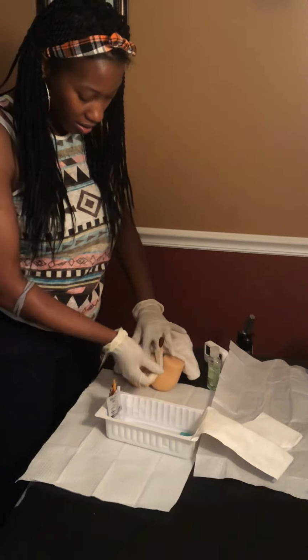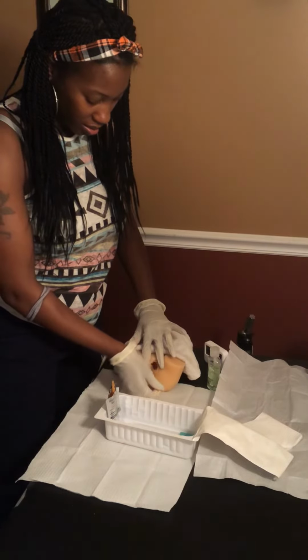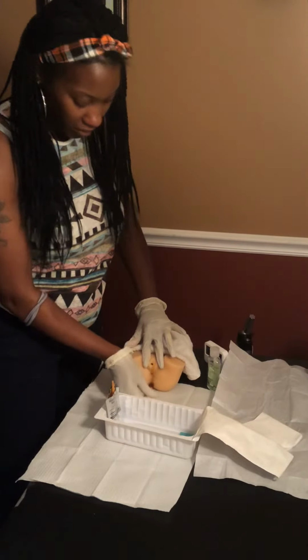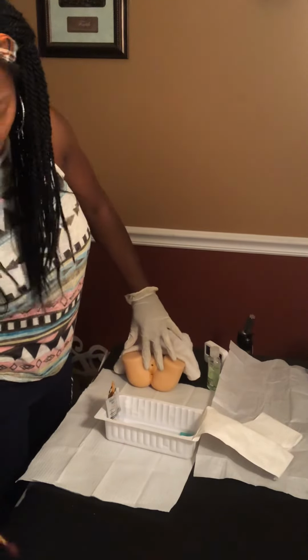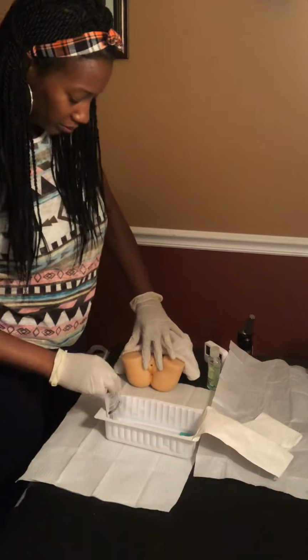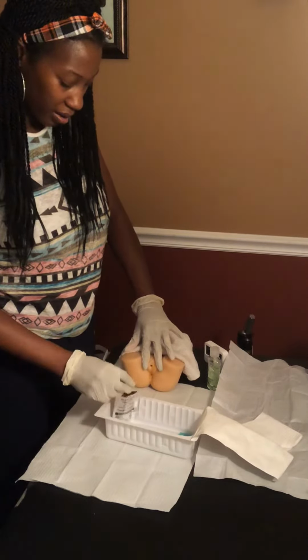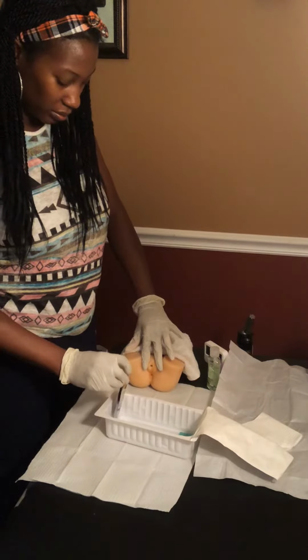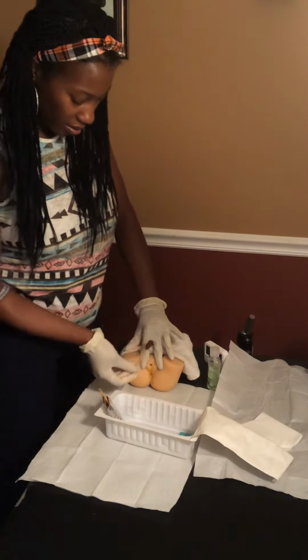Far labia. One swipe down. That in the trash. Front to back. Near labia.